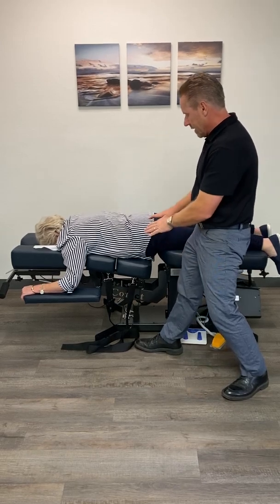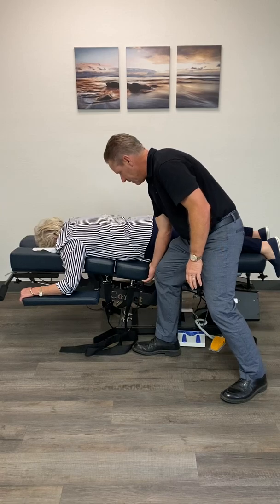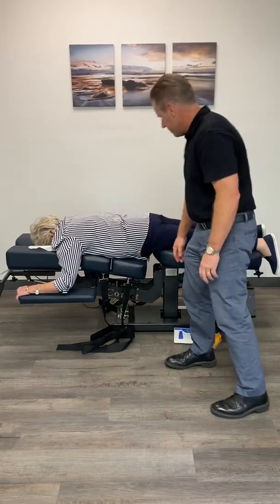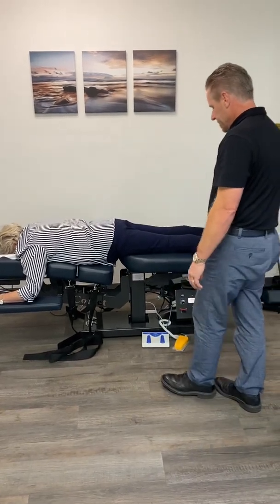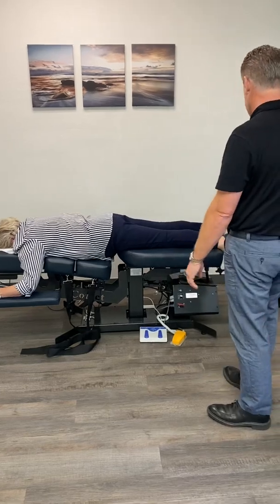So I showed you how to do it with the person on the table, but if so, you better be ready to have some weight here. Again, safest thing is to make this adjustment beforehand. So now we have just a little bit of lordosis going on there. And this thing does do traction, but we're gonna start with motion first, okay?